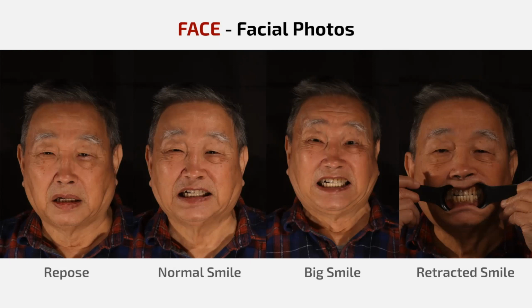Some labs will also ask you for some kind of a profile photo, and they want some kind of look from the side. Usually, even the profile photo can be taken care of with a good bite record.